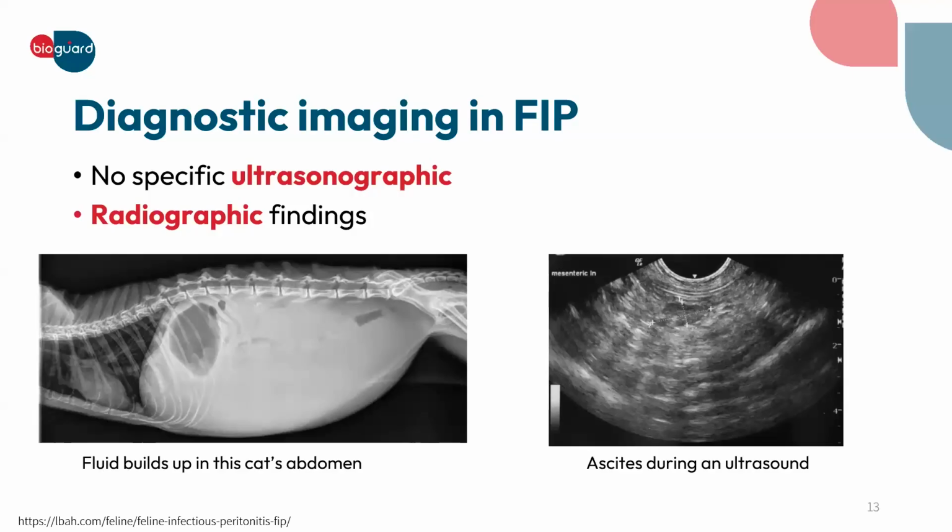Sometimes vets take out some of the fluid and check again, because the organs are not clearly observed inside the body when radiography is done. However, when the fluid is taken out, you can still see some of the organs, which can give a clear sign of FIP detection.